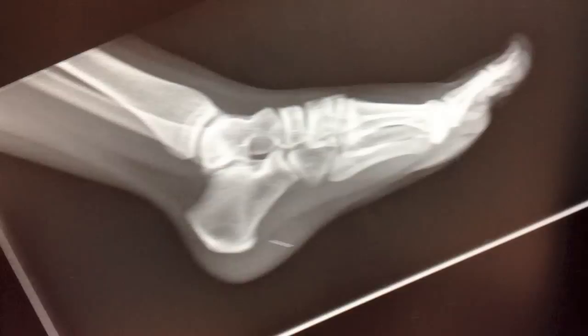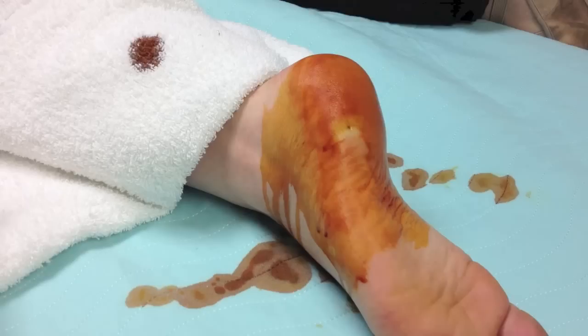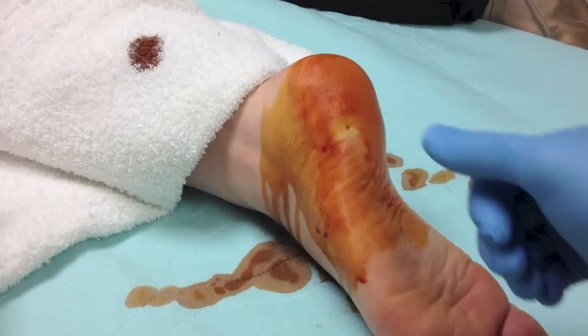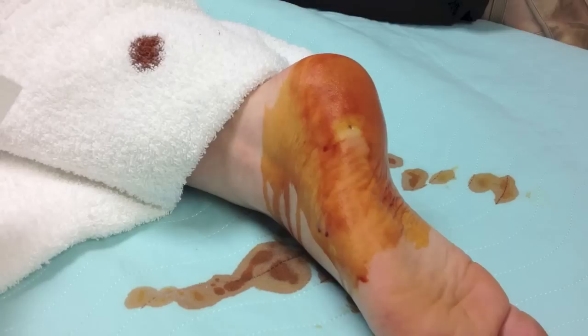Let's summarize what we got here for the educational component. My patient stepped on a needle and the needle went in — it's just a couple millimeters off the surface and it broke off. The family tried to get to it but couldn't. We already injected some medicine; that's why you see the little white area around it — that's the lidocaine, causing a little vasoconstriction effect there. We let it go for a couple minutes so it should be pretty numb.